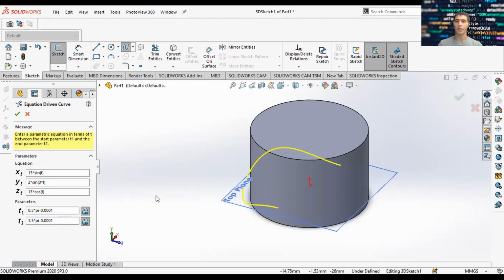These functions mean that basically we're giving it parameters from half pi minus a small value to 1.5 pi minus a small value. The reason why you include the small value is so that it doesn't give an exact pi answer, because I think that's undefined. But then from these parameters T1 to T2, you want to plot these curves. And so once you have these curves, click OK.